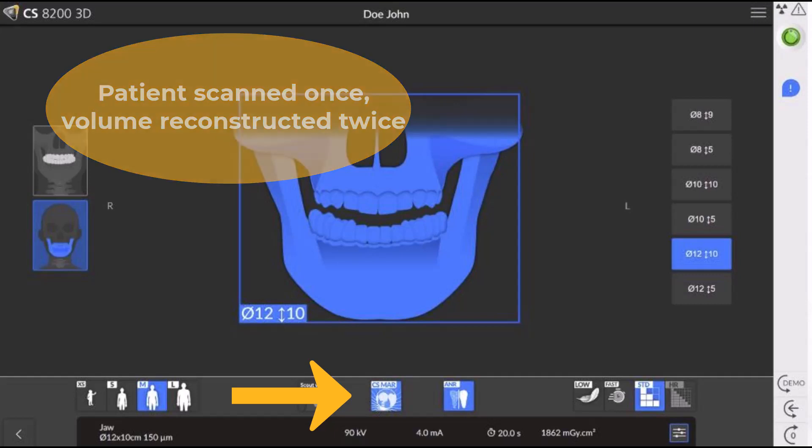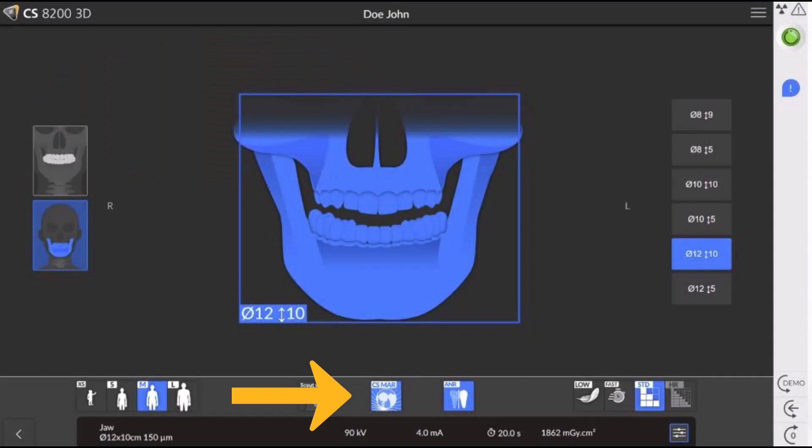The main reason for choosing to run MAR automatically at acquisition is simply that you know that patient has lots of metal in their mouth. You know the patient, you're going to run the MAR, so you might as well just run it at acquisition.